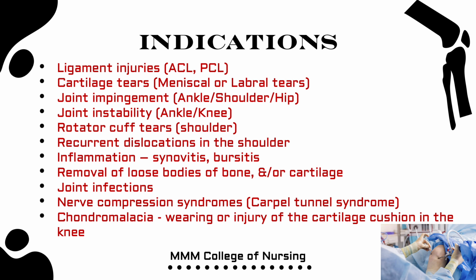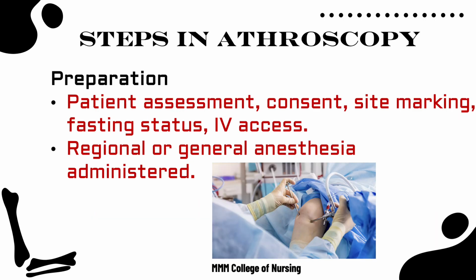Arthroscopy can also be used to remove loose bodies of bone and/or cartilage, in cases of joint infections, in nerve compression syndromes, commonly carpal tunnel syndrome, and in chondromalacia, which is a wearing or injury of the cartilage cushion in the knee. Let's look at the steps in arthroscopy.